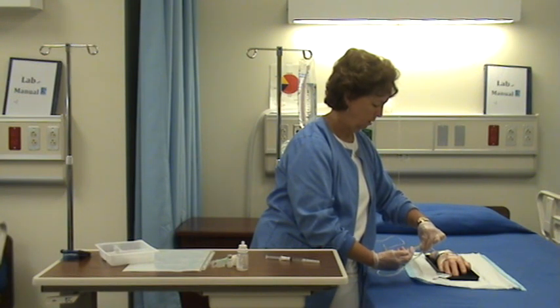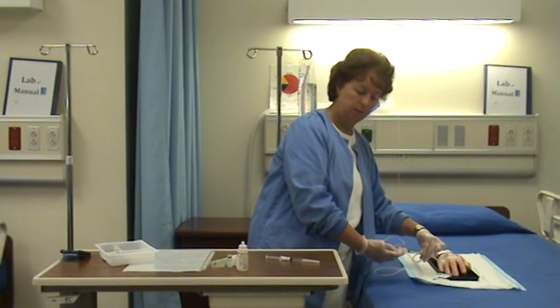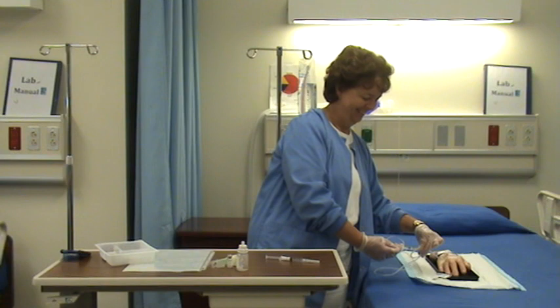And another 1/4. And while you're doing this, you're assessing the site and making sure that it's not infiltrated. A minute can seem like a long time.